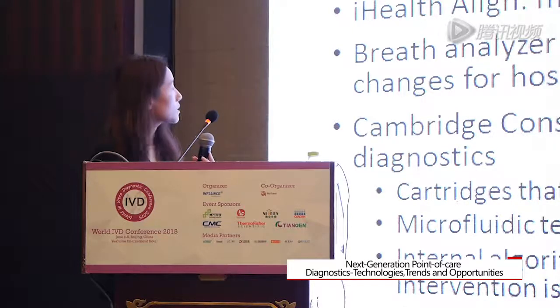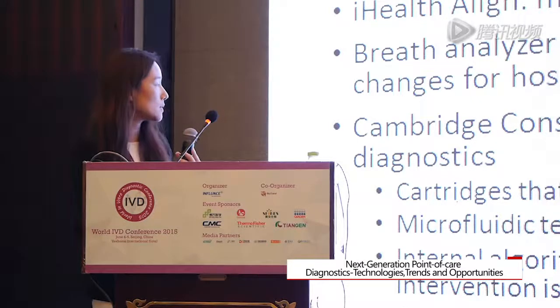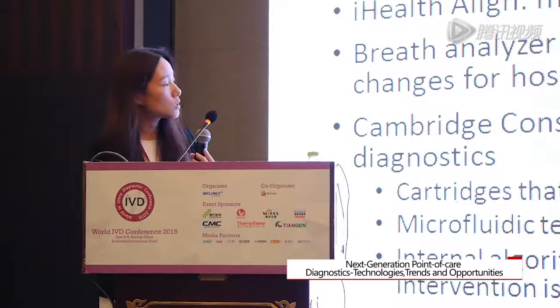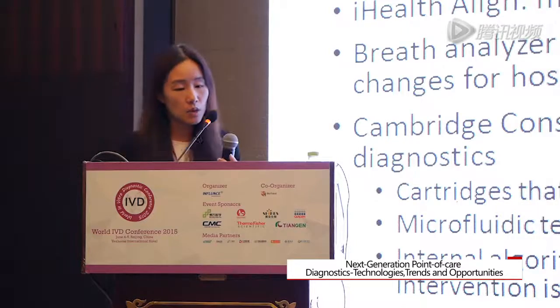A company called Cambridge Consultants came up with such an idea called Flow Health Hub. As you can see, it's a round instrument. It looks kind of like a vacuum. And then you can insert different cartridges into the instrument here. With many of the cartridges, you can conduct many routine clinical chemistry tests, such as sodium electrolytes and enzyme assays as well. And then these instruments will transmit your data remotely to your physician. And if intervention is necessary, then that can be done as well.